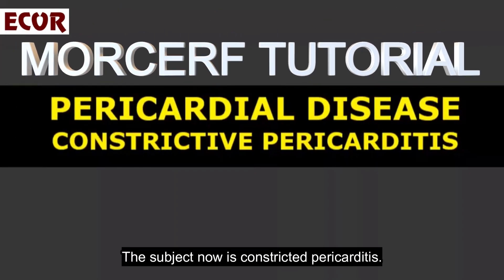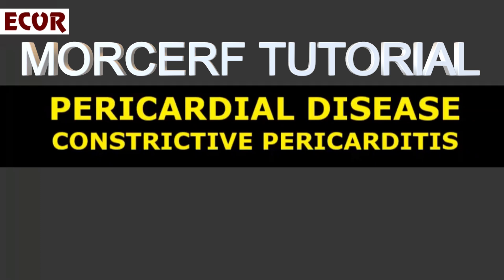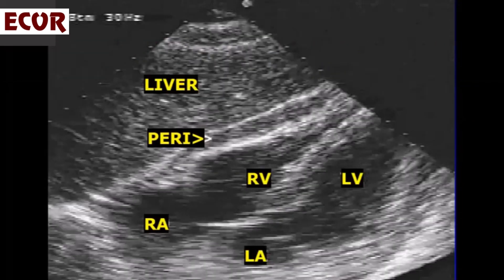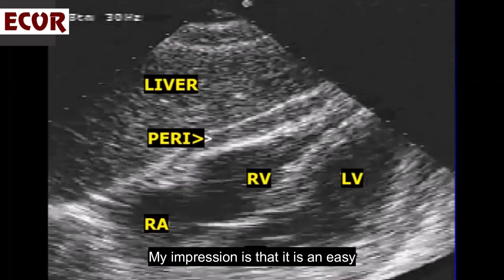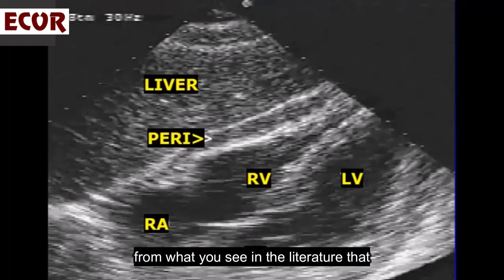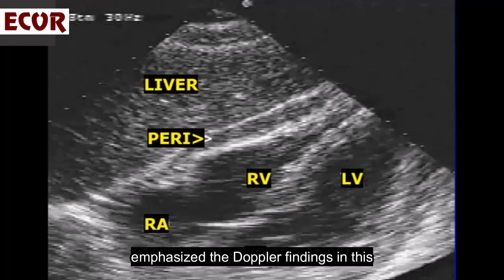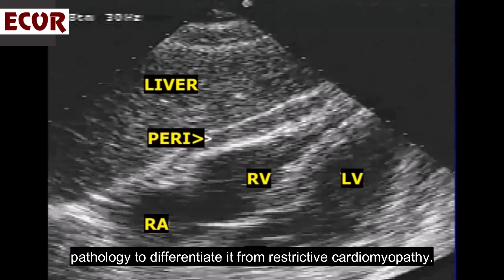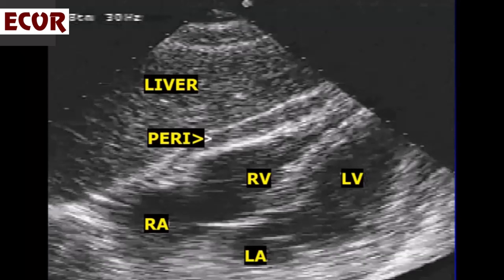The subject now is constrictive pericarditis. My impression is that it is an easy diagnosis made by 2D ECHO, and very different from what you see in the literature that emphasizes Doppler findings in this pathology to differentiate it from restrictive cardiomyopathy.